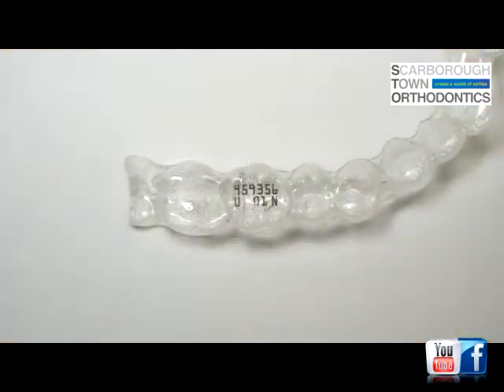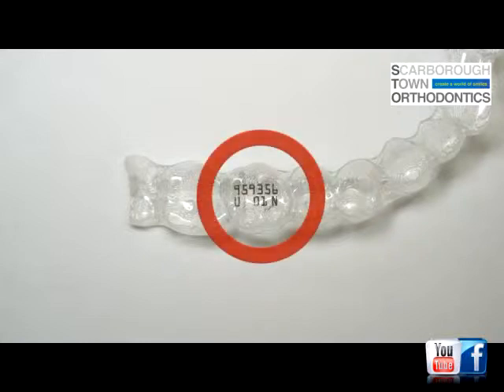In case you get the aligners mixed up, it is clearly indicated on the aligner. You'll notice a U printed on it or an L. U for upper, L for lower, as well as the number of aligner that it is. So your first aligner will be printed with 01.